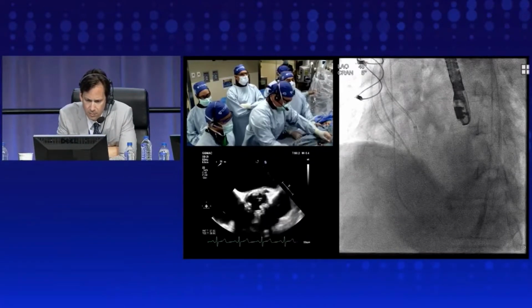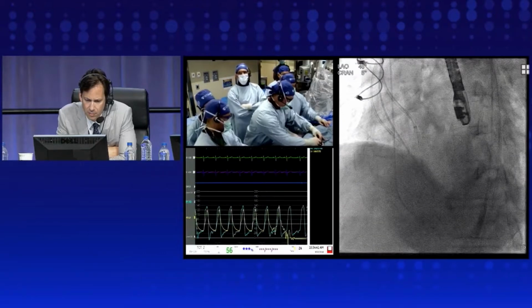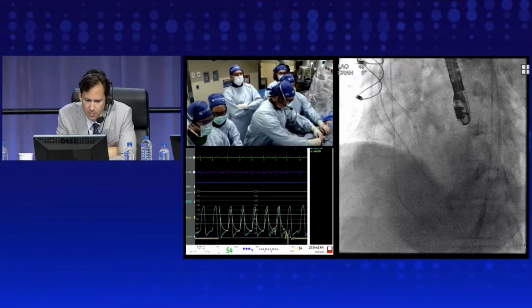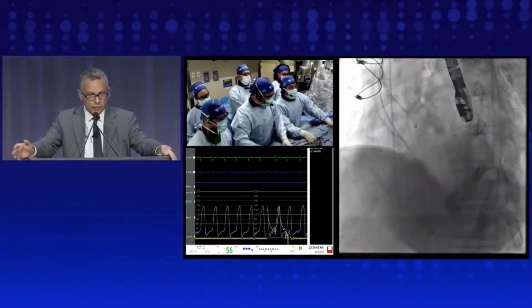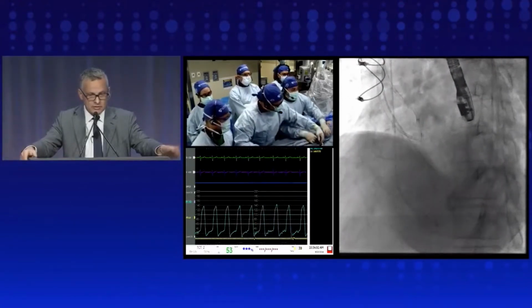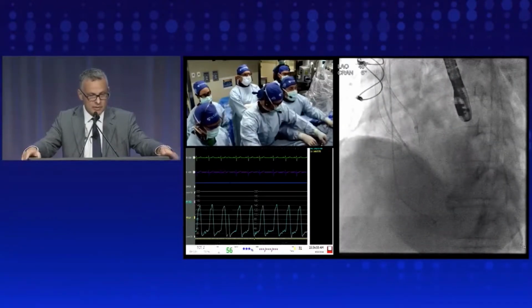You can actually see the hemodynamics both in the aorta and the LV. Could you show the hemodynamics? Thank you. Yeah, so you have equalization of pressures at this point. So we don't want to interrupt you in the flow because I think it's going to be a challenging time point. So you go forward. We don't ask you questions at this time.